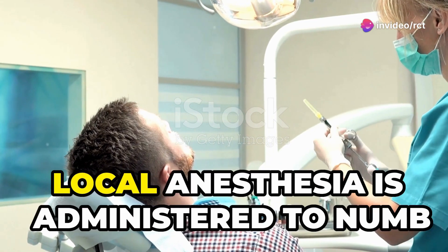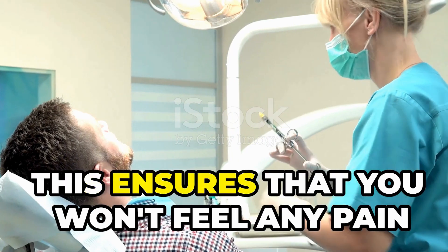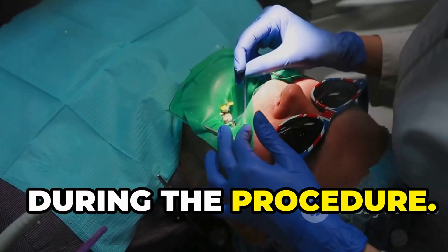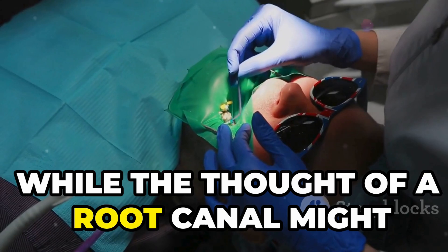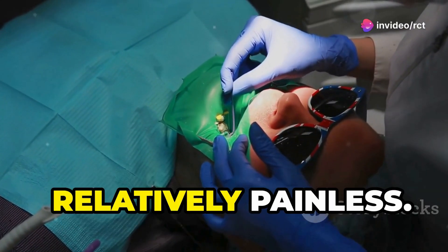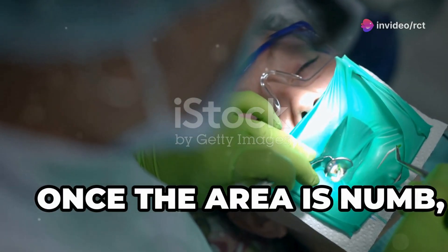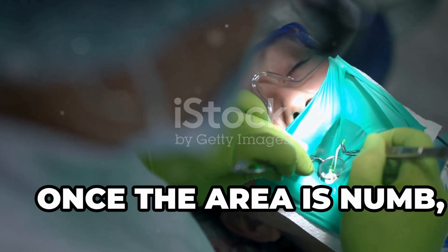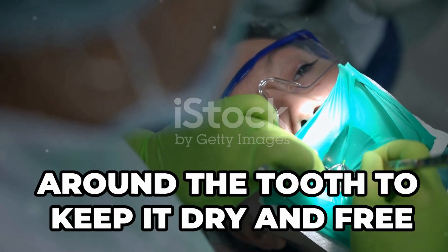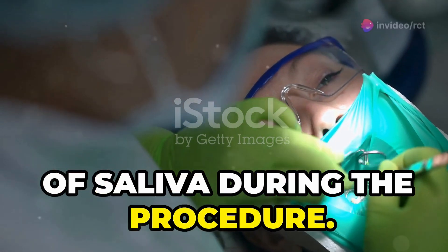Next, local anesthesia is administered to numb the affected area. This ensures that you won't feel any pain during the procedure. While the thought of a root canal might sound intimidating, modern dentistry techniques make it relatively painless. Once the area is numb, the dentist will place a rubber dam around the tooth to keep it dry and free of saliva during the procedure.